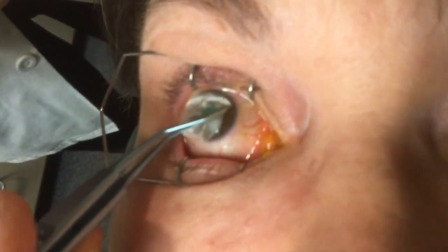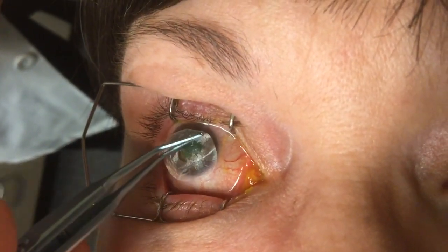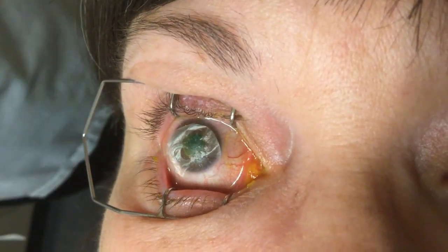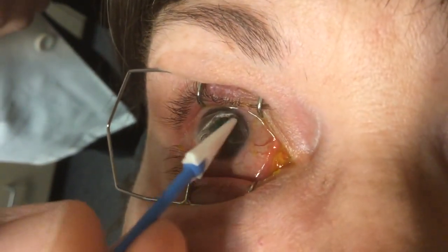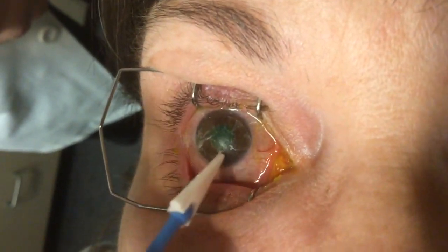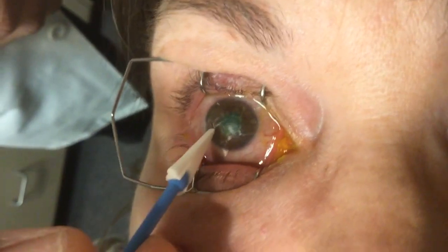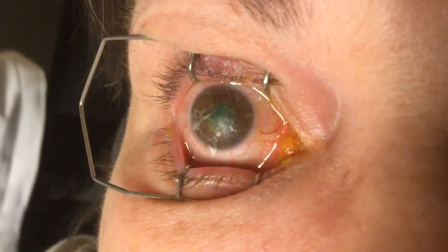Get that spear. Curse it. All right. Larry, if you want to make a joke, this is the time to do it. Be nice.